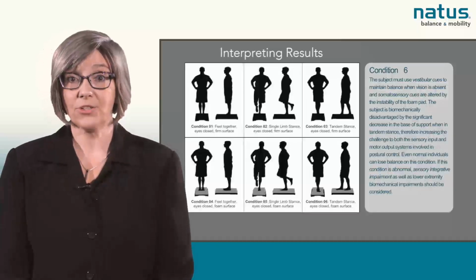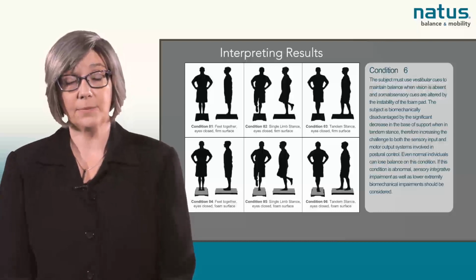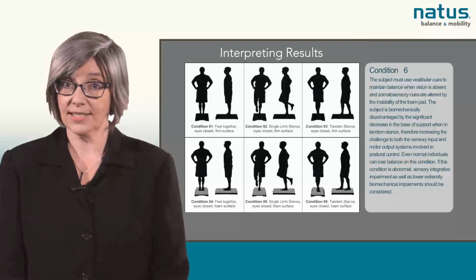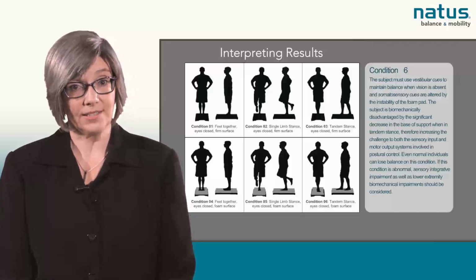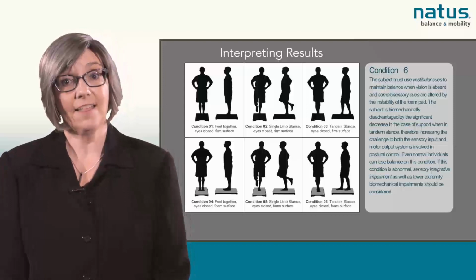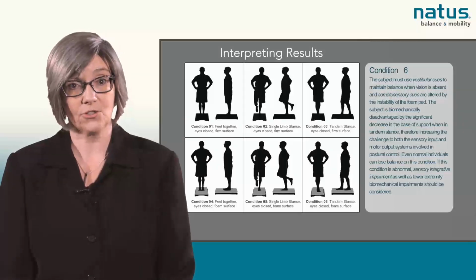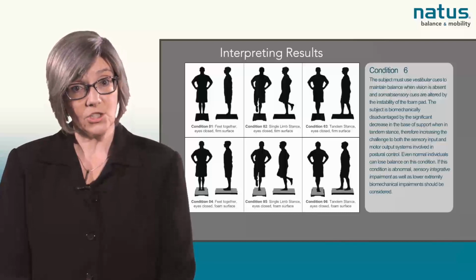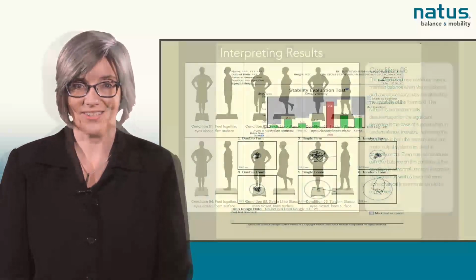Condition 6 requires the patient to assume tandem stance on the foam pad, placing the non-dominant leg behind. The hands are on the hips and the eyes are closed. The patient must use vestibular cues to maintain balance when vision is absent. Somatosensory cues are altered by the instability of the foam pad. The patient is biomechanically disadvantaged by the significant decrease in the base of support when in tandem stance, therefore increasing the challenge to both the sensory input and the motor output systems involved in postural control. Even normal individuals can lose balance on this condition. If this condition is abnormal, sensory integrative impairment as well as lower extremity biomechanical impairments should be considered.